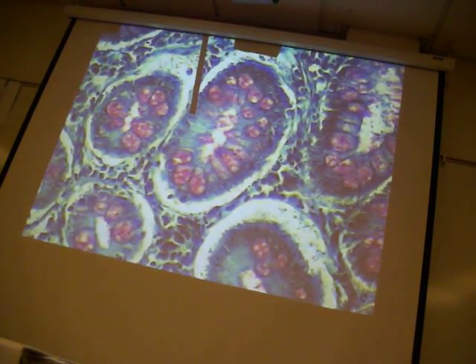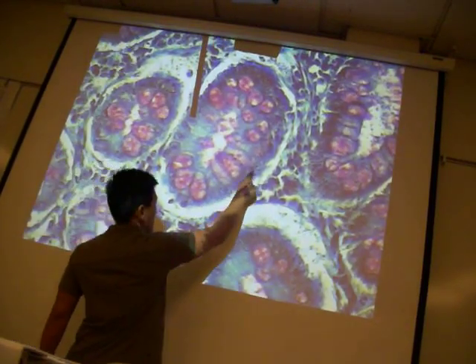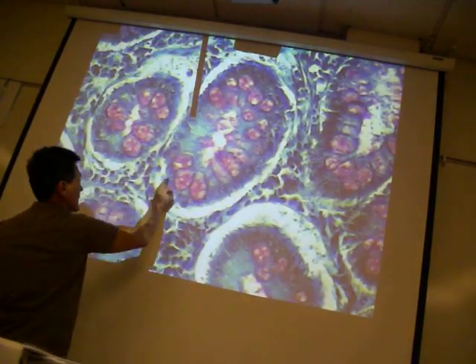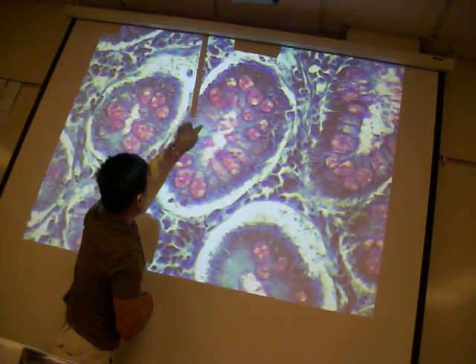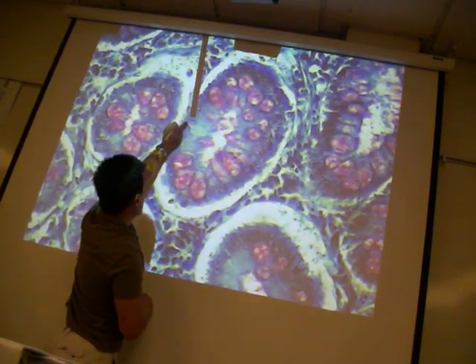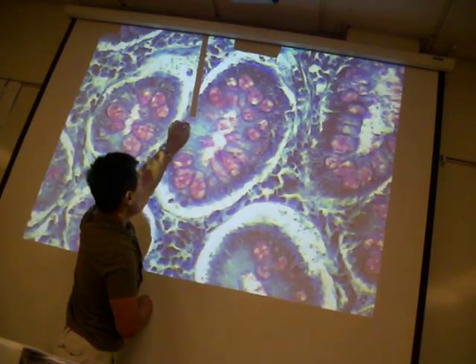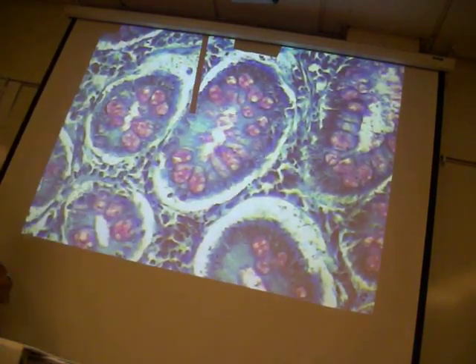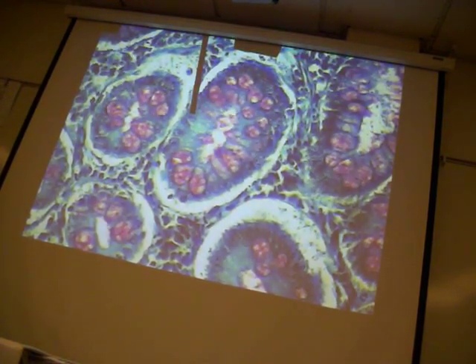So because this is forming a little tubule, you'll see all of the nuclei right here, right through here. So you can see the edge of the cell. These are taller. Here's the edge of these cells right here. They're taller than they are wide. So think of it like a brick standing up on end. That's what you're looking at with these cells right here.